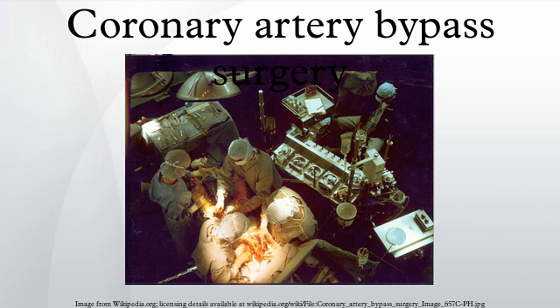Procedure: the patient is brought to the operating room and moved onto the operating table. An anesthetist places a variety of intravenous lines and injects a pain-killing agent followed within minutes by an induction agent to render the patient unconscious. An endotracheal tube is inserted and secured by the anesthetist and mechanical ventilation is started. General anesthesia is maintained by a continuous very slow injection of propofol.